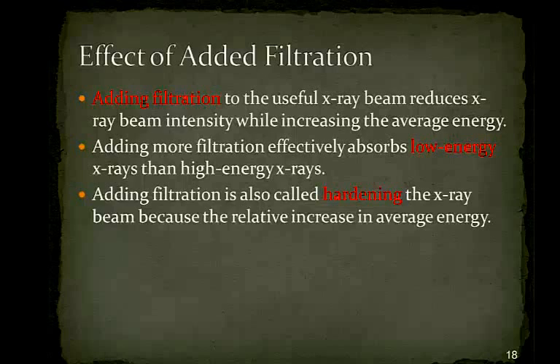Very important, and I'll say it now. Generally, there are different things we could use for filtration, but in the tube, we generally use aluminum. And again, a lot of what we're going to cover is usually going to be between aluminum and lead. It's so important for you to understand that you cannot use lead. So we're in the X-ray tube right now.